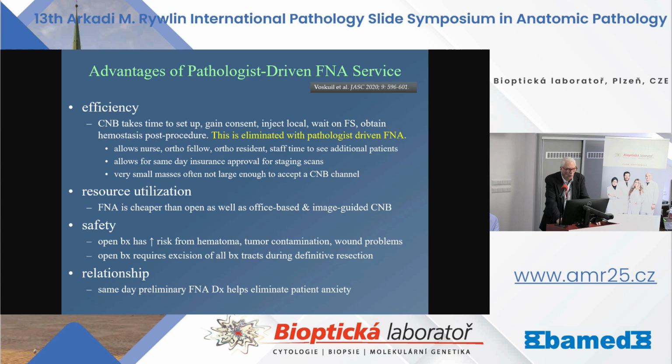Efficiency. Core needle biopsy, at least in the United States and in our place, takes time to set up. You have to gain consent. You have to inject a local anesthesia. You have to then wait on the frozen section to see if you got diagnostic material. Then you have to obtain hemostasis post-procedure. As you see, I've highlighted in yellow, this is eliminated with pathologist-driven FNA.